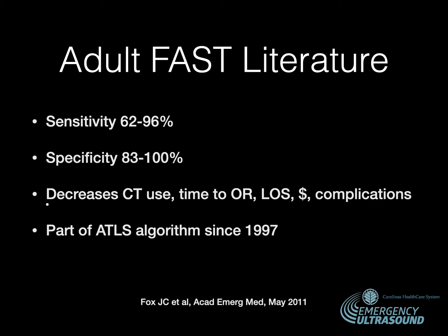If you have a positive FAST, you're done. If they are stable, you go to CT. If you're unstable, to the OR, but definitely not going home. If you have a negative result, you may still miss injury or fluid, so correlate clinically, which means you need to do a good physical exam with your suspicion of injury. Some patients can go home. They might be observed with serial FAST exams, or if they're having a lot of abdominal tenderness, move on to CT. It all depends on how your patient is presenting.